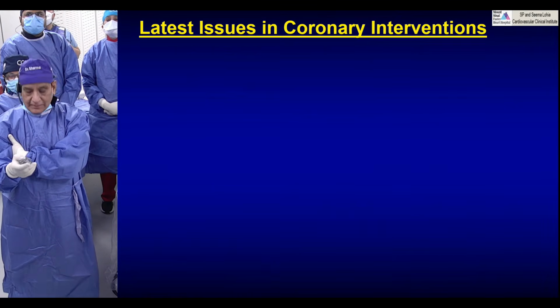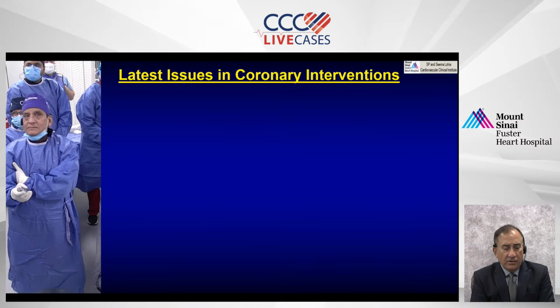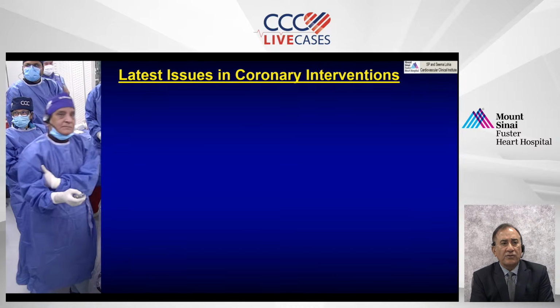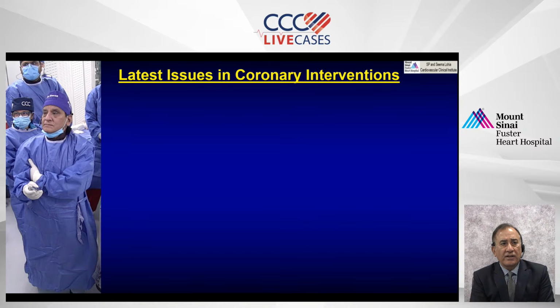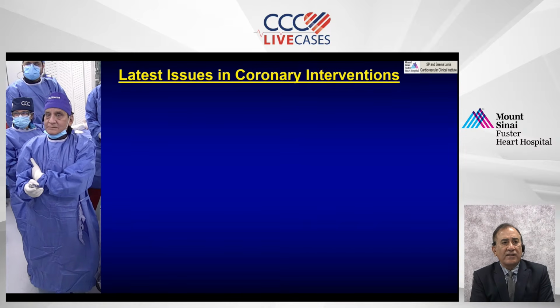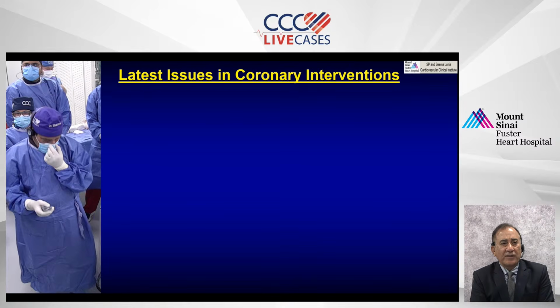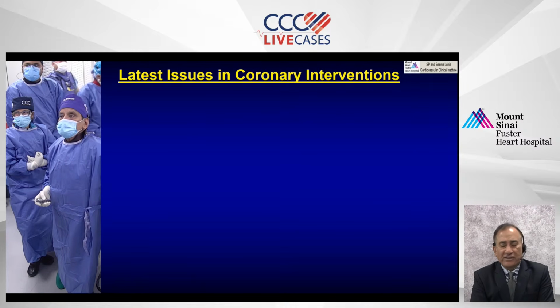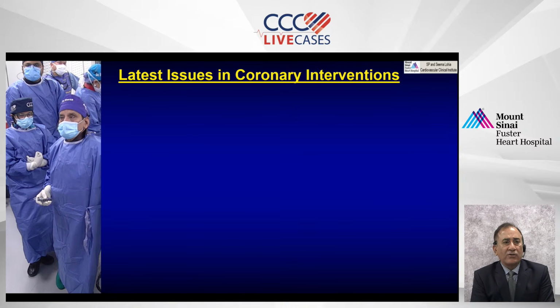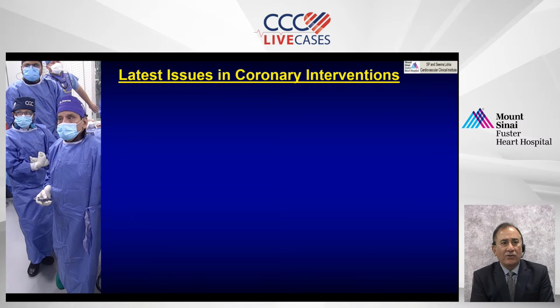Yeah, I have one observation and a prediction. The observation is, I think the incredible point coming out of your presentation is that, in your particular eyes, after possibly three to four decades of doing complex PCI, you feel the biggest value of imaging is post-procedure. That to me is the brilliant statement which you made, which I think people can relate to. Second, looking into the future, I think you'll take a picture and an AI-guided algorithm will tell you whether the lesion should have IVUS or not.